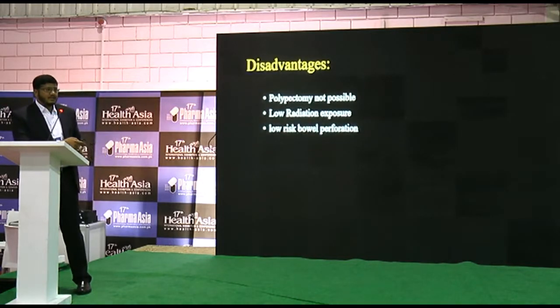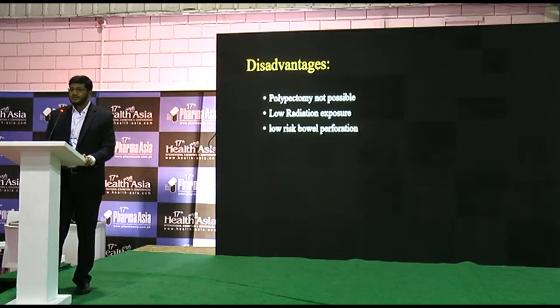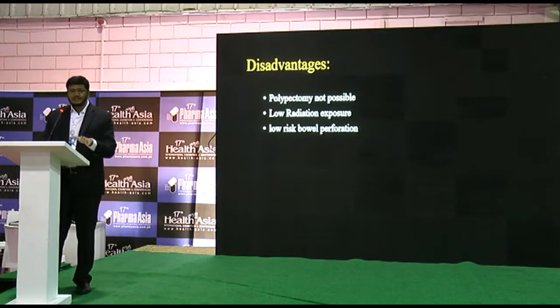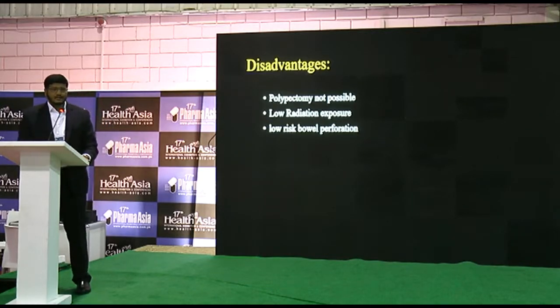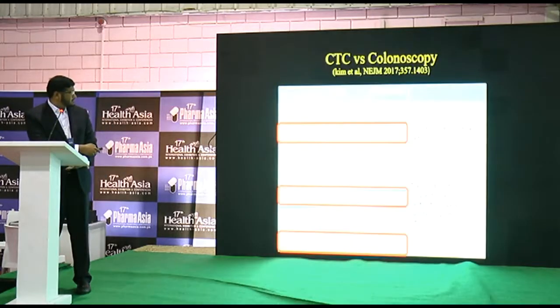So there are some disadvantages. Polypectomy is not possible if you are doing CT colonography, and there is a very low risk of radiation, which I'll discuss later. There is also a very small chance of bowel perforation in the literature.